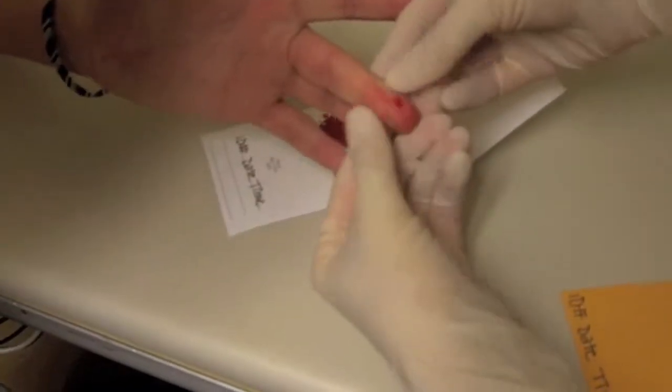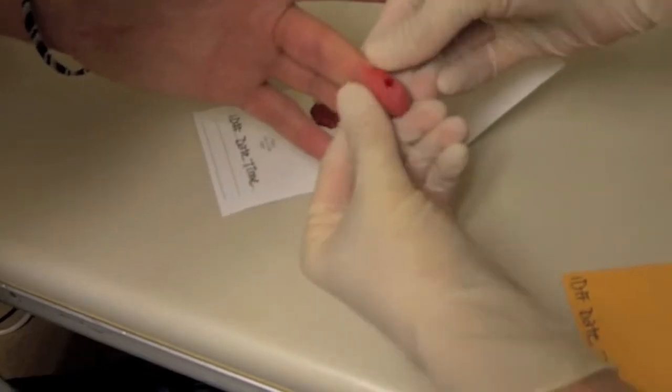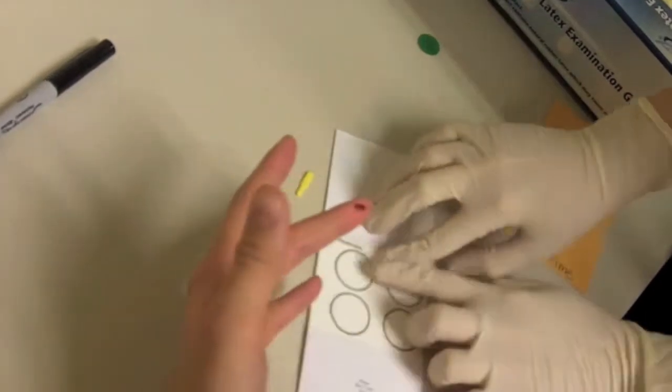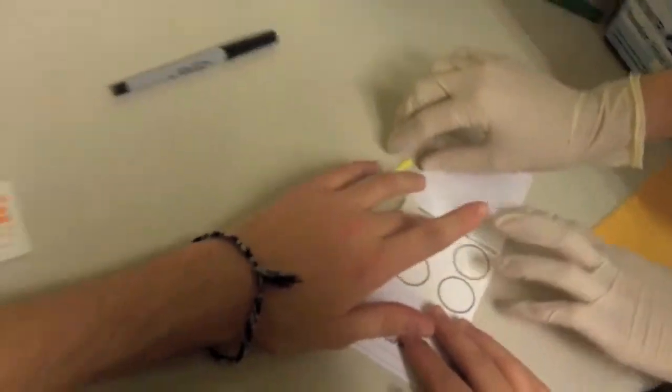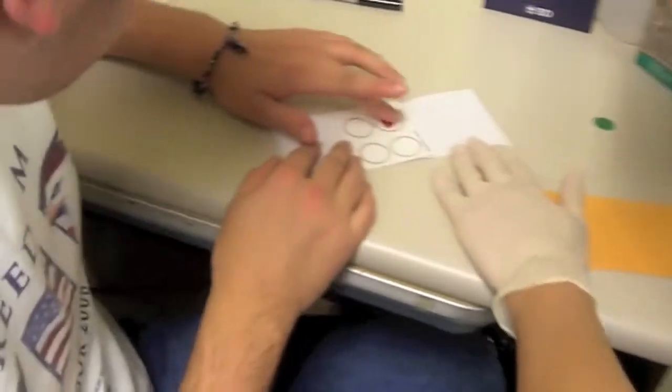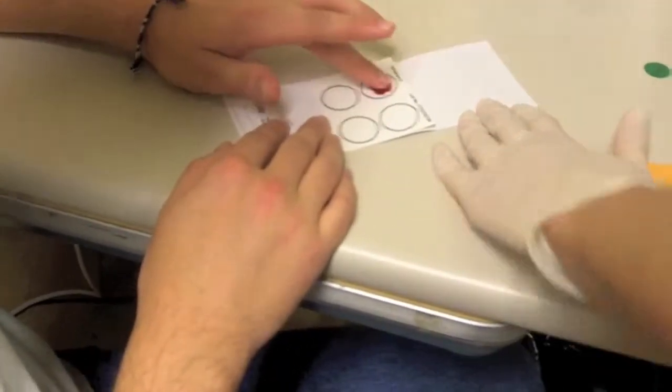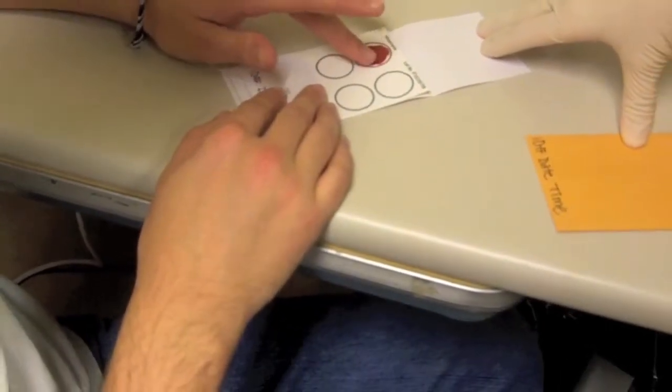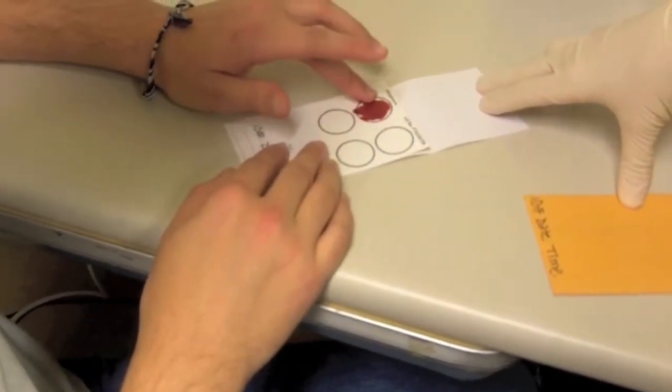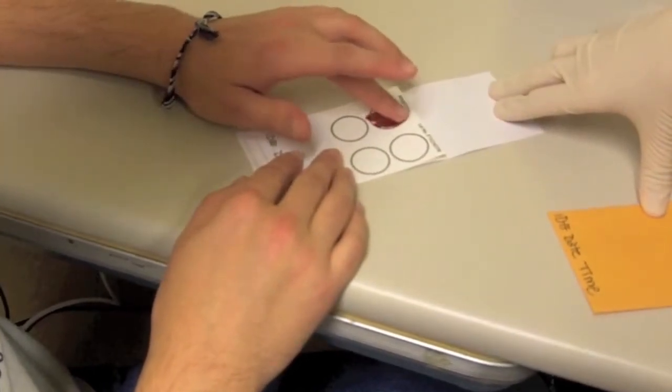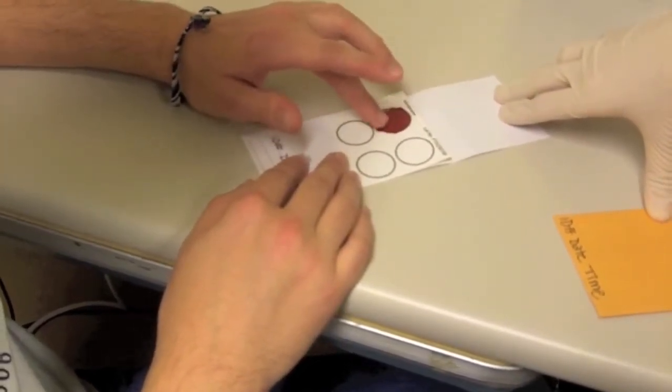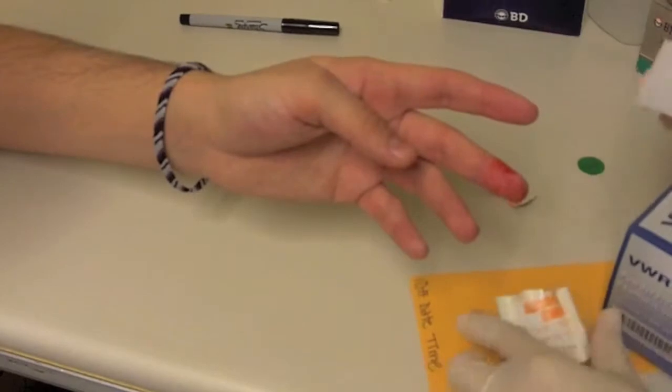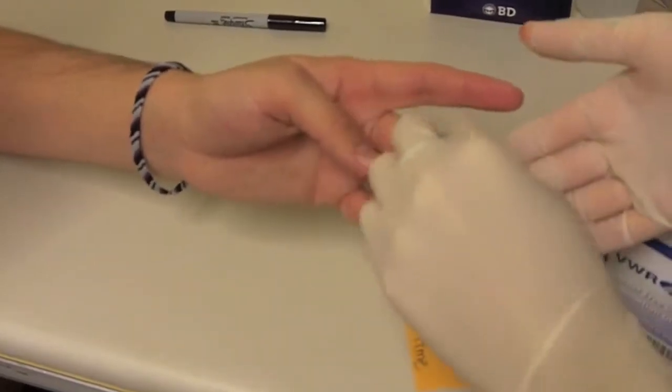Once the participant's finger has been pricked, instruct the participant to begin milking the blood. To do this, take the other hand and pull forward towards the tip of the pricked finger. This should be done slowly as the blood may come out fast. Squeezing the tip of the finger may also achieve the desired effect. As blood drops from the tip, the pricked finger should be dabbed onto the FTA paper inside one of the circles. The participant should repeat the milking action to bring blood forward into the finger and dab it onto the paper. Instruct the participant to fill as much of each of the circles as possible. It is best for all circles to be completely filled in.